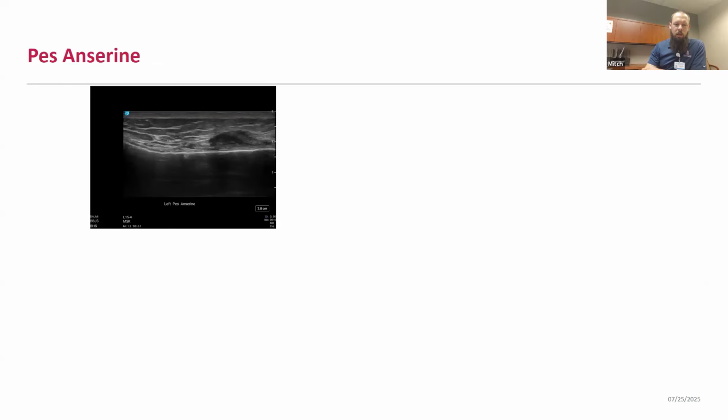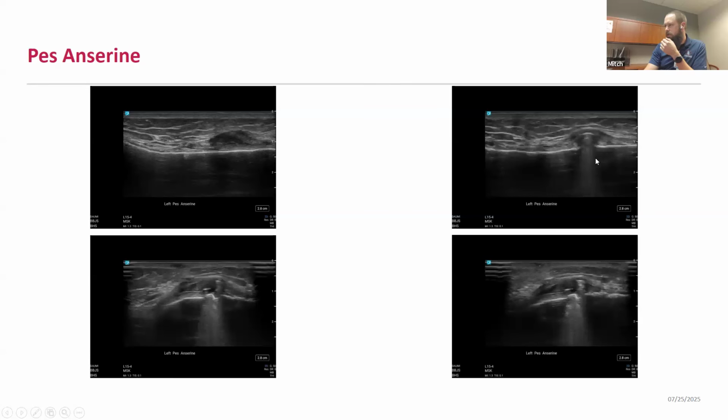So getting back to the case of the athlete that I presented initially, this is his long axis view of the MCL and the Pes Anserine complex, and we can see, compared to the initial evaluation, a significant abnormality at the Pes Anserinus. Here we see one of our tendons, but then a lot of hypoechogenicity and evidence of swelling or bursitis present in this area. And then as I scan medial to lateral across these areas, I also see additional abnormalities within that complex.